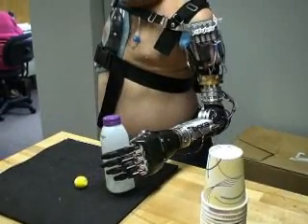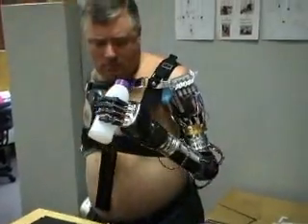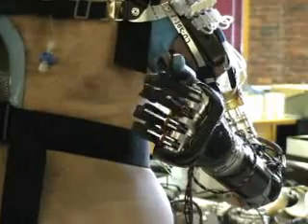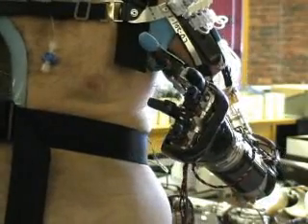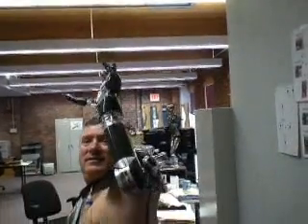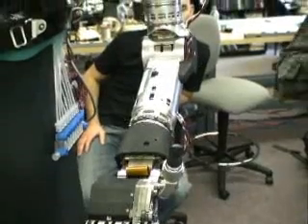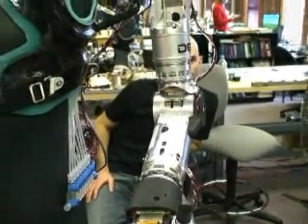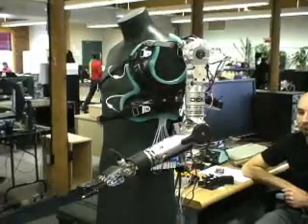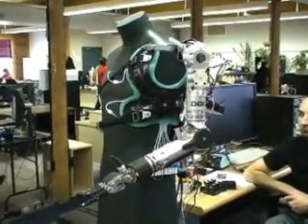Weight is another big challenge in making a prosthetic practical. You have to make an arm that is anatomically correct, and then you have to make it weigh as little as possible. Engineers modeled the Luke arm on an average female arm. This particular arm actually weighs less than eight pounds — including all the electronics and the battery.